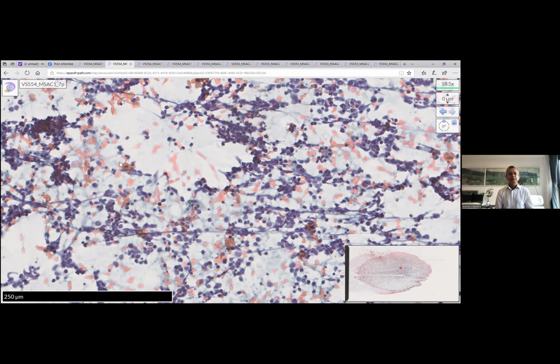So that's in terms of what's reported in real life as well. If you have the differential, or at the time of rapid on-site evaluation and bronchoscopy, you really were stuck and thought, I can't really be 100% sure. I favor this to be a small cell carcinoma, but I want to rule out a high-grade lymphoma. I need a bit more time. And you should be able to have that discussion or conversation with the respiratory physician.